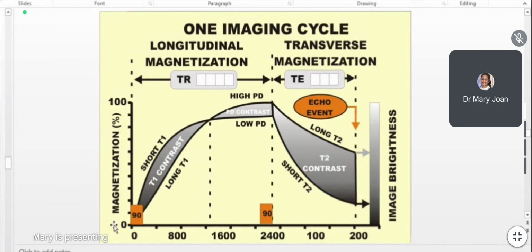You can see that the brightness across T1 is bigger, meaning there are darker areas, lighter areas and bright areas, whereas the contrast between low PD and high PD is more or less in the same region, so the contrast is lower. Long T2 and short T2 give a wide range of brightness, giving rise to better contrast.